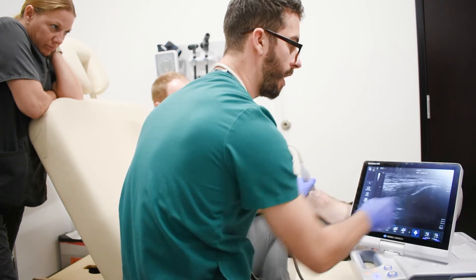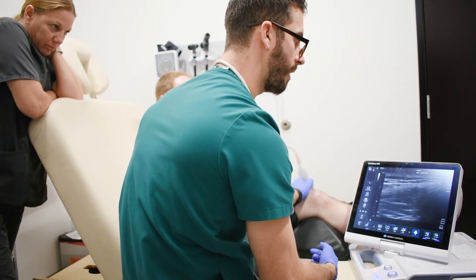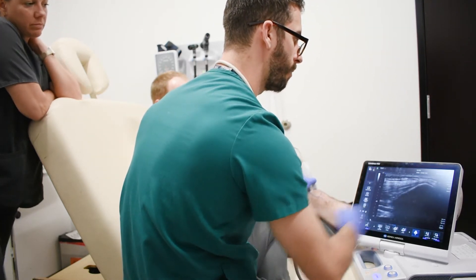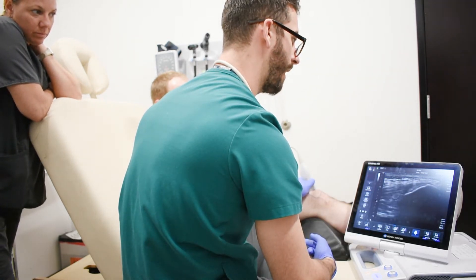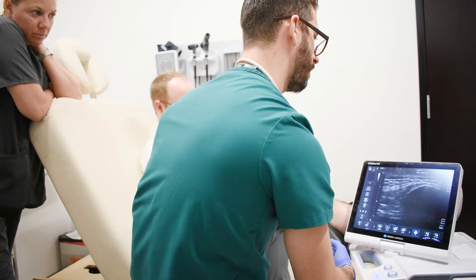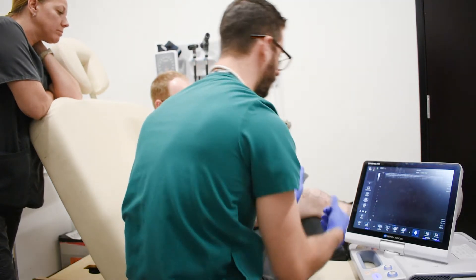The first thing you're going to want to find is the patella. So here we have patella — this makes our quadriceps tendon. You can scan through and you can see here's the medial aspect of it. There are the most medial fibers of vastus medialis inserting, and then you can fan out laterally and follow it all the way out to where the most lateral fibers of vastus lateralis are inserting over here.